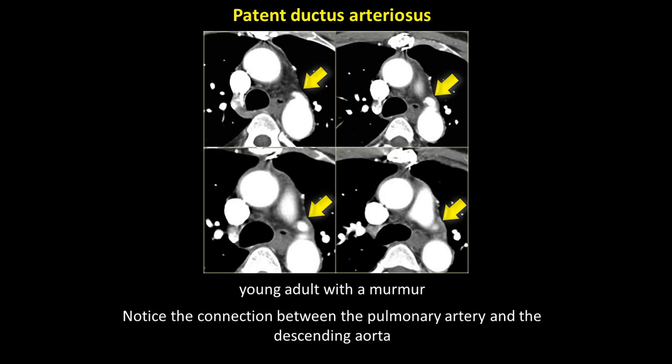So this ductus arteriosus is usually patent in the embryological age, right? And then at birth, when the neonate starts to breathe, because of the difference of the pressure, it closes functionally. But then in a few weeks it will close totally and change into what is called ligamentum arteriosus, right? But in this case, it remained patent and it's carrying the blood from the descending aorta to the pulmonary artery.